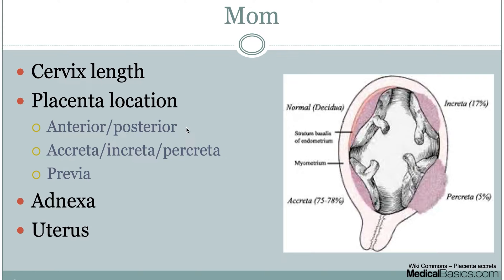The first thing is going to be looking at the mom. The cervix and the placenta are your major things when it comes to pregnancy. Cervical length is important — making sure this is adequate for childbearing. Shortened cervical length predisposes patients to preterm labor. If it's shorter, there's less muscle and a much shorter path, increasing the likelihood of delivery before the baby is due. Documenting cervical length tells us whether we need closer follow-ups or whether a cerclage procedure is needed to prevent preterm labor.